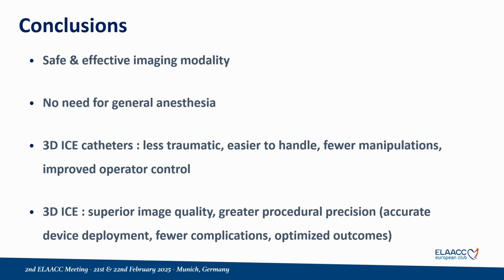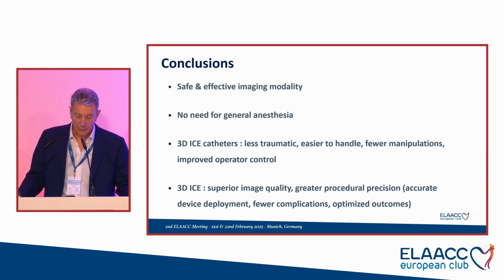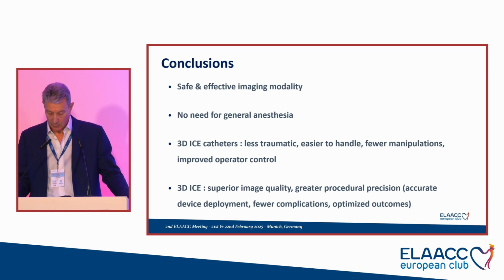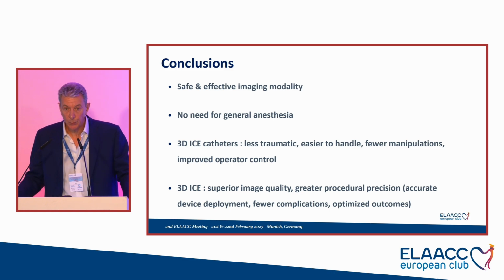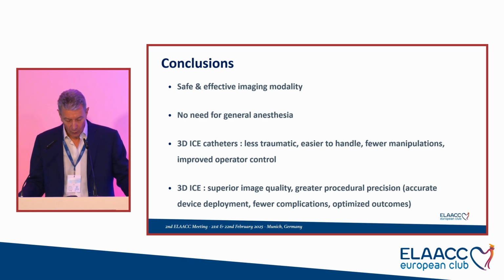Okay, my conclusion is that ICE is a safe and effective imaging modality. We don't need general anesthesia. We don't need an additional physician for the TOE. The 3D ICE is less traumatic, easier to handle. It requires fewer manipulations and improves operator control and comfort.